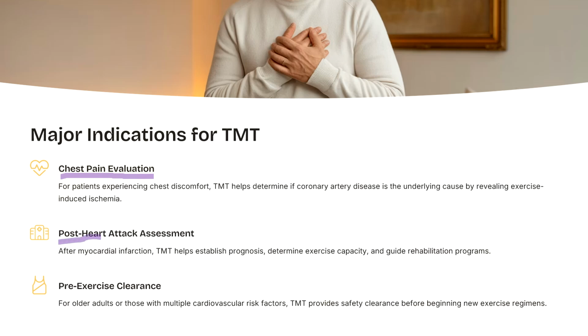Next, post heart attack assessment. After myocardial infarction, TMT helps establish prognosis, determine exercise capacity, and guide the rehabilitation program. That is, after myocardial infarction, how the heart works.